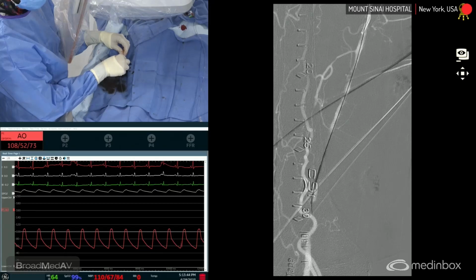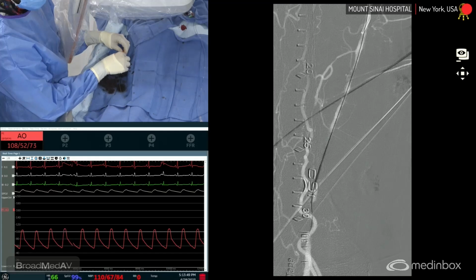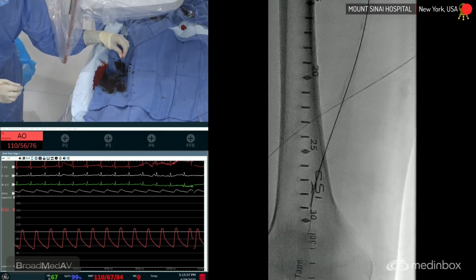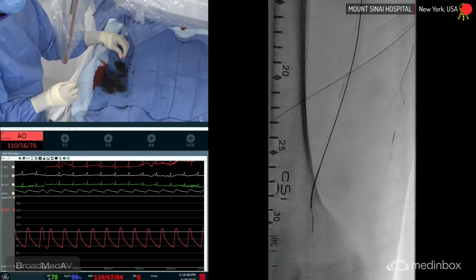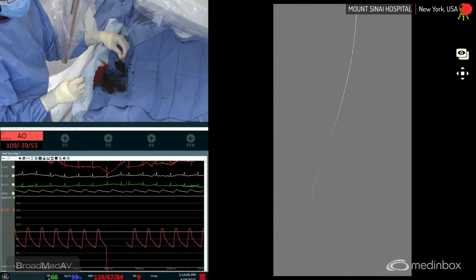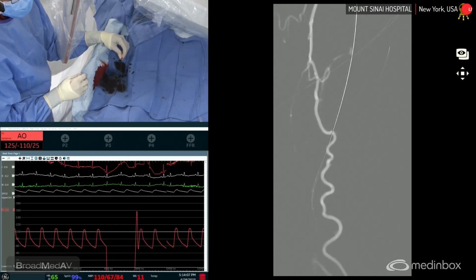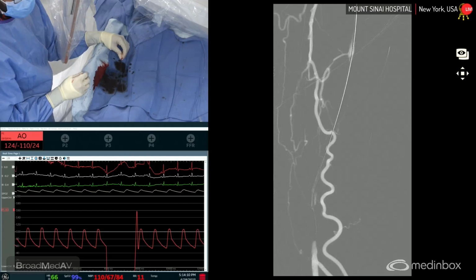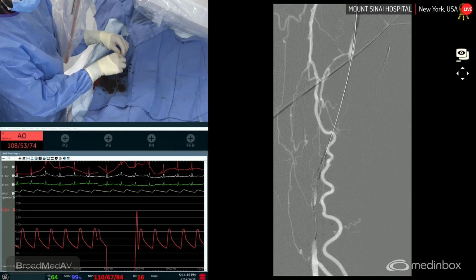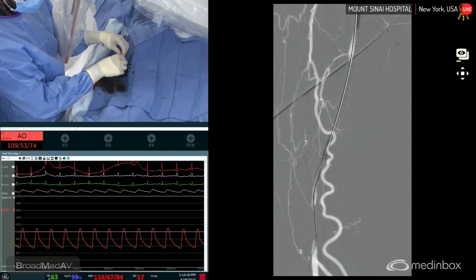So we're going to try to cross here, and likely we're going to cross without a problem. As you see, the high tip load wire really seems to go and find the channel that we want to find. I'm just going to go to another view to show Dr. Ibrahim where we are. Creatinine is normal, but even then we don't want to give too much dye, as everybody knows. So we're heading okay. I should be able to find the lumen. Let's see. We're hopefully going to find the lumen in a second. And we have found the lumen, as you can see. Looks like we have. No, maybe not.